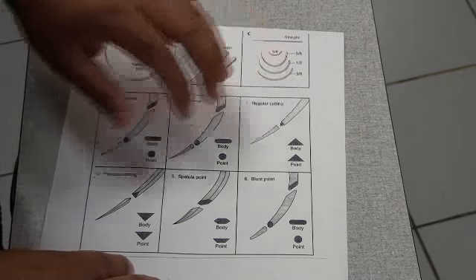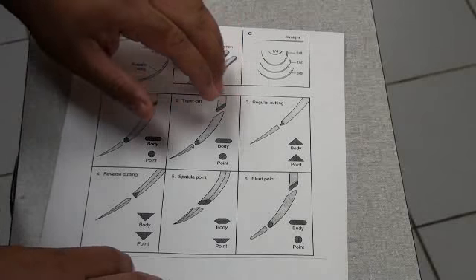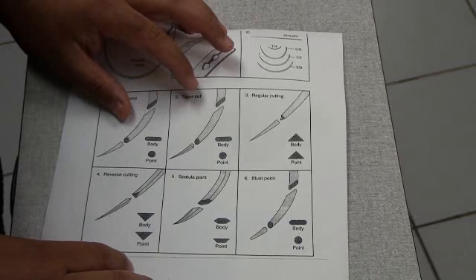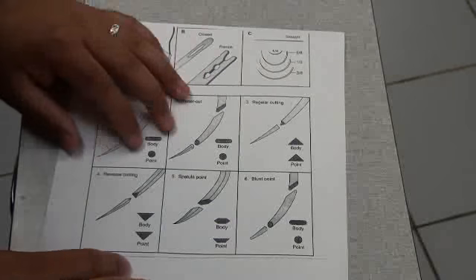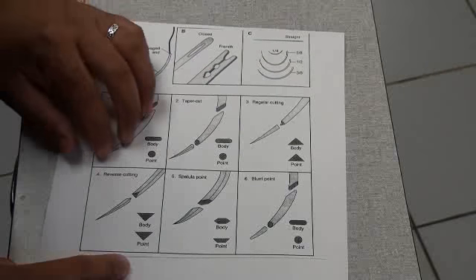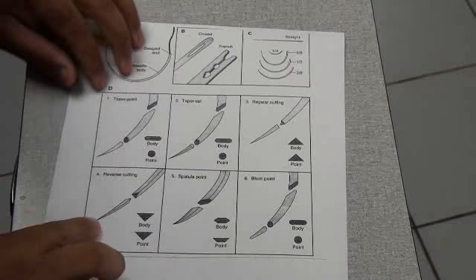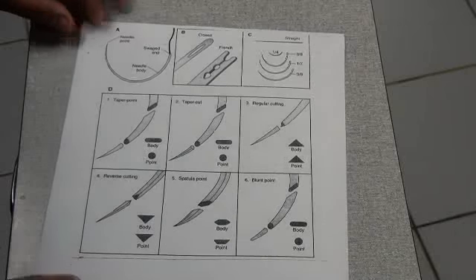It's potentially most traumatic since the curve of the cut is towards the wound. It can be used in tendons, ligaments, and skin, but not in anything like the urinary bladder or intestines or lungs. Same goes for the reverse cutting. You can use that in tendons, ligaments, and skin as well.